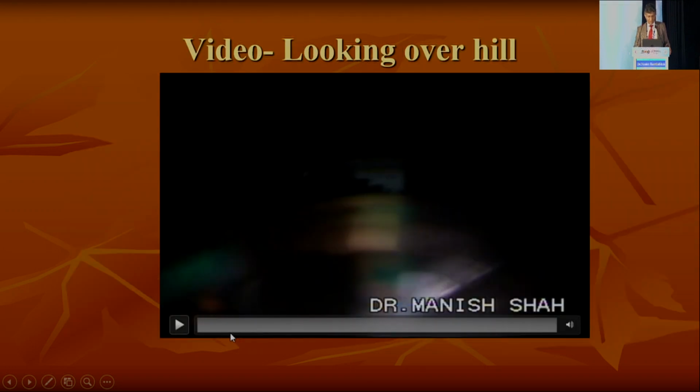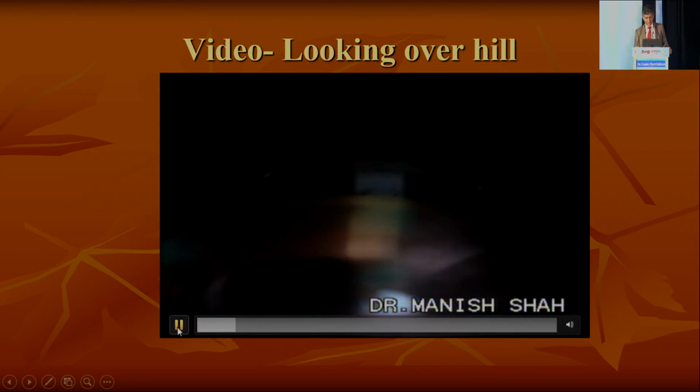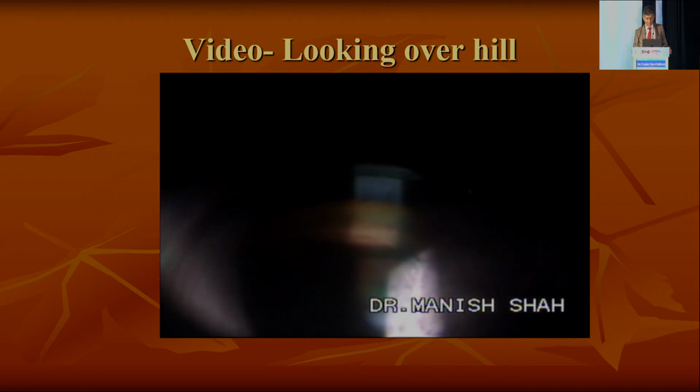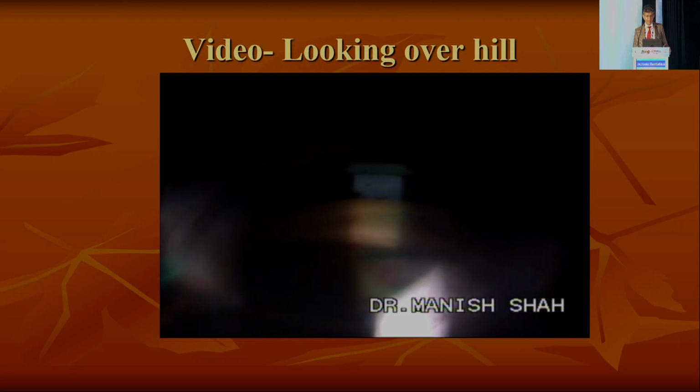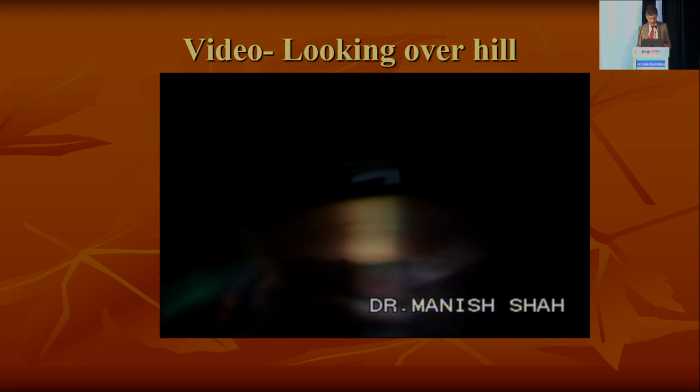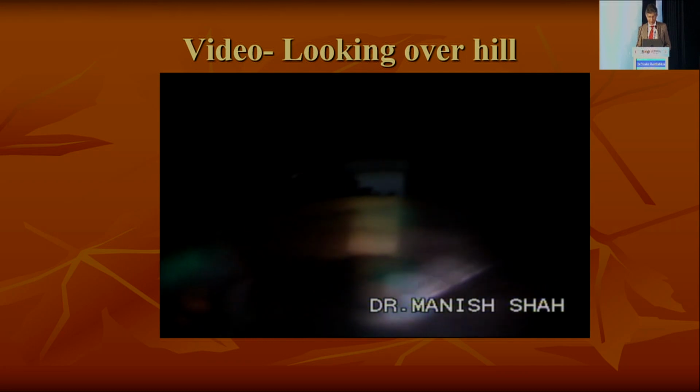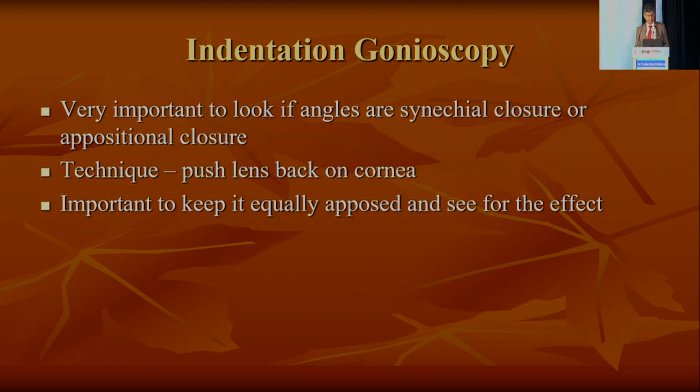So this is a video which actually shows that when you are looking first along the iris plane, you can't see any angle structures. A little tilt and all the angle structures become visible, as you can see. So this is just a peripherally bulging iris, but it is not essentially a closed angle. Of course, it is an angle at risk which can close later on.